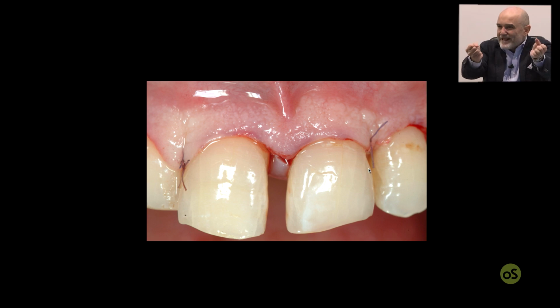So by coronally advancing the flap and anchoring it to the adjacent deepithelialized anatomic papilla, you compensate the tendency of the soft tissue to collapse.